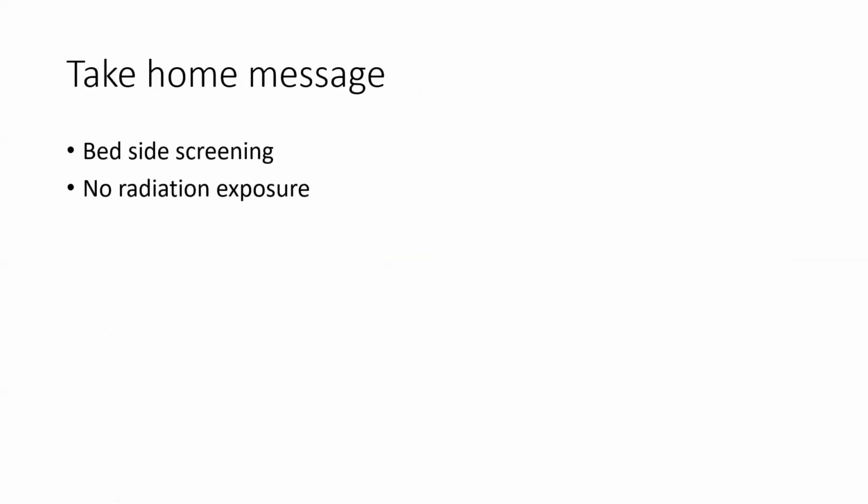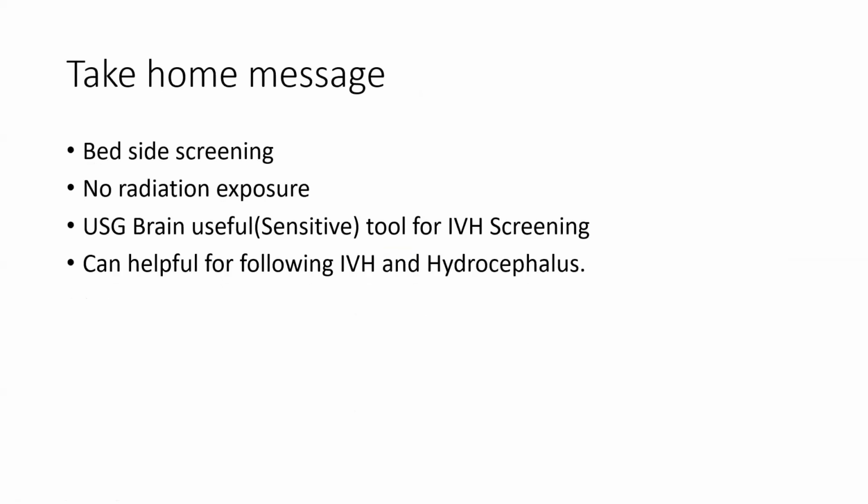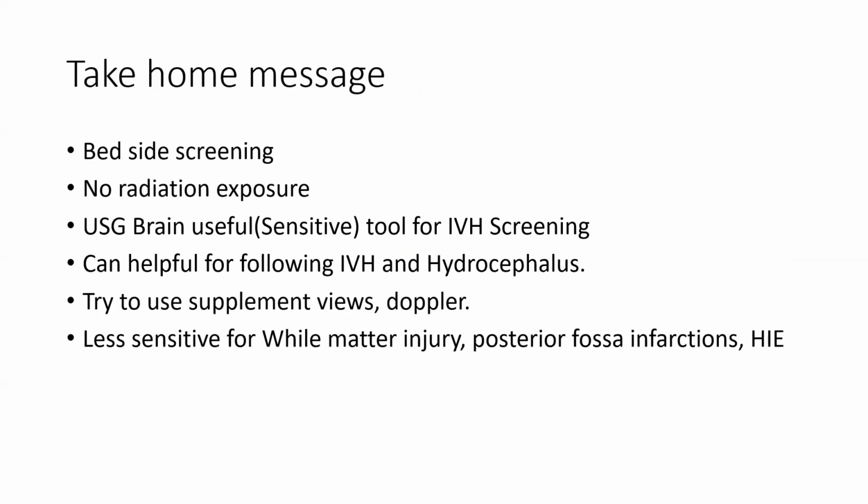So take home message would be that it is a very easy scan. When I take the POCUS session, most of the time I say to each and every delegate that lung ultrasound is the easiest ultrasound in the world, followed by head ultrasound, which is again the easiest one, and followed by your difficult one, echo. Okay, there would be no radiation exposure if you do frequent monitoring. It is a very sensitive tool for IVH screening, and also you can monitor hydrocephalus with the various indices.